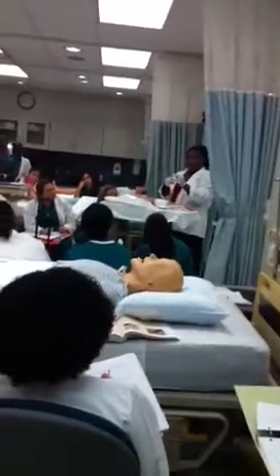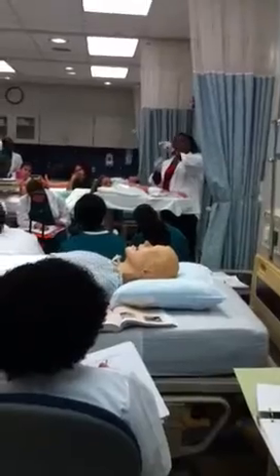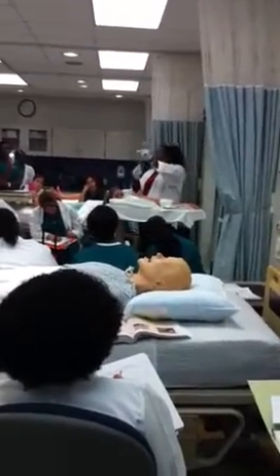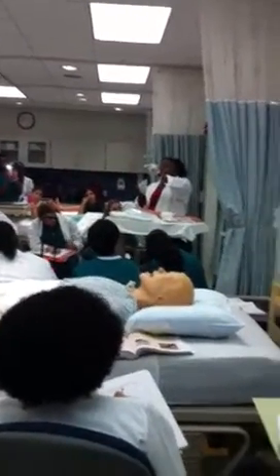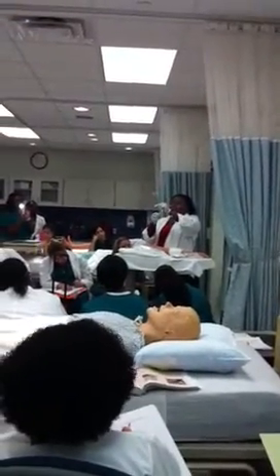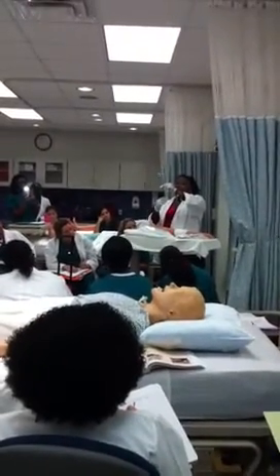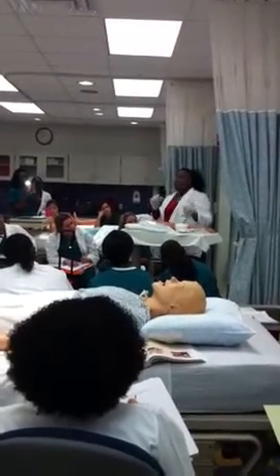Go in, push in, drop my 10. I could draw up to 35 units at this point. I could fill up the syringe. Alright, I have my 10. Tap, get the bubbles out. Now I can push it back in until I get my 10.